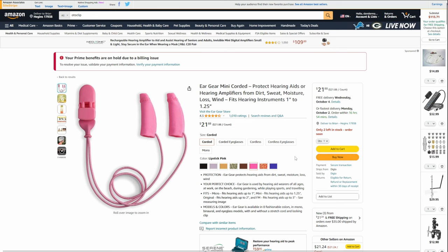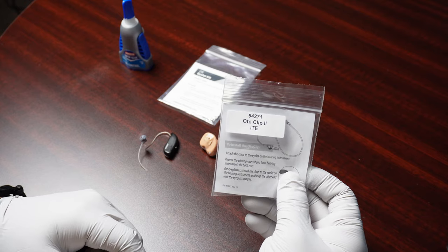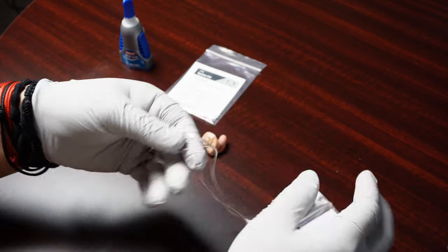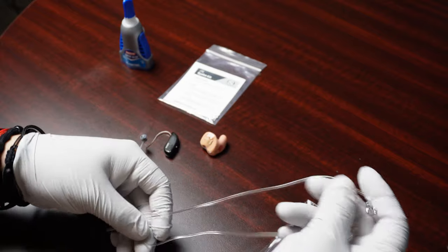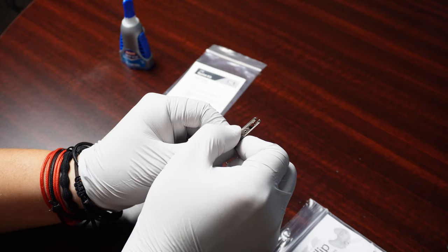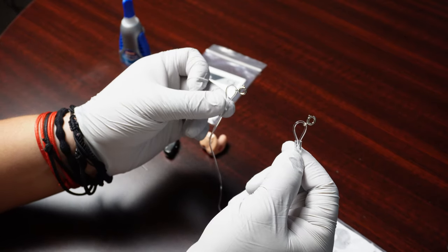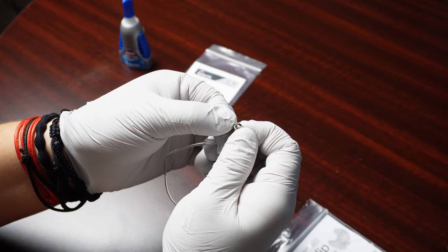Now let's go install these little eyelets so that you have something for your Otoclip to attach to. So here is the Otoclip. It just consists of a lanyard, a little clear cable on one end. It has an alligator clip, which is going to attach to your shirt. And then on the other end, it's got two little clasps, and those are going to attach to each one of your custom hearing aids.